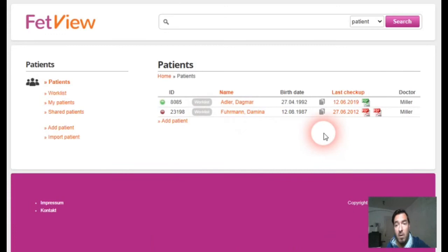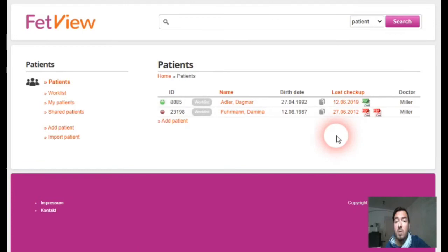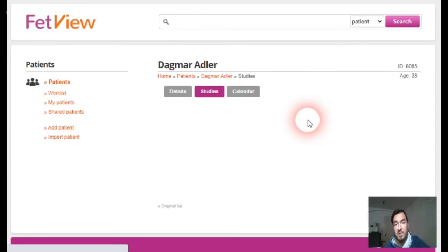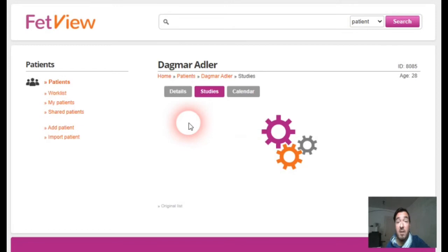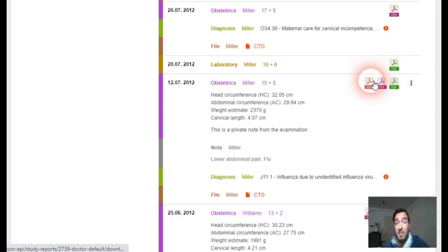All generated reports can be accessed directly from the last examination in the patient list. Here you can see the maternity log, laboratory, or the reports of the last examination. If you want to search for all reports, go to the patient timeline where every report for every single examination is available. You can just click on the picture.